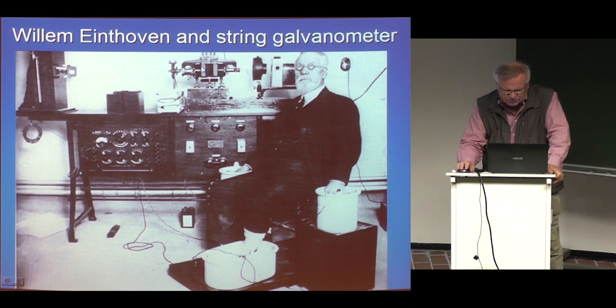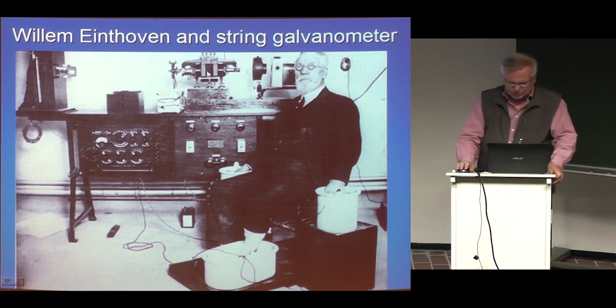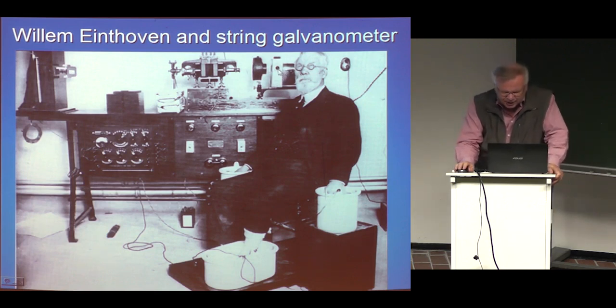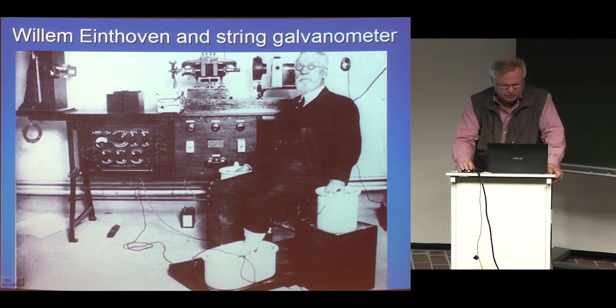This is here the string galvanometer instrument itself. The string is here. I show you it in some later slides. Here, just behind the head of the patient, you see a very bright light source, an arc lamp, and the light is going through mirrors, a lens system, going through this string galvanometer and going here on the left to this film. There is photographic film running here, and the shade of the string galvanometer wire is recorded.